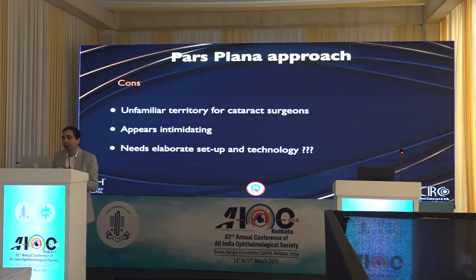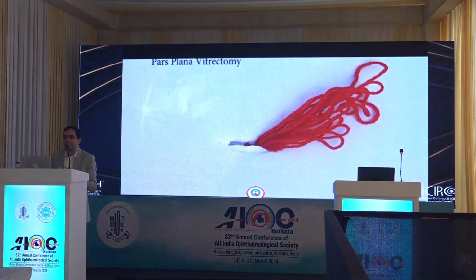and quite often causes turbulence at the capsular tear margin. Coming to the pars plana approach, we always find it intimidating that we are not retinal surgeons, how can we enter through the pars plana? And do I need separate machines, separate instruments, and so forth? So fortunately, not much is needed.